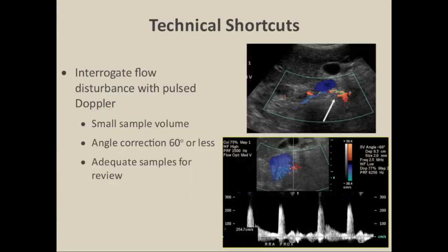Other technical shortcuts: use a small sample volume, usually 2 to 3 millimeters, placed within the vessel in the area of interest. Angle-correct at 60 degrees or less so we don't have artificially elevated peak systolic velocities, and make sure we have adequate waveform samples to determine the peak systolic velocity at each segment.